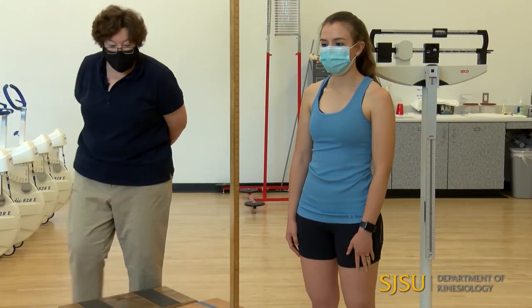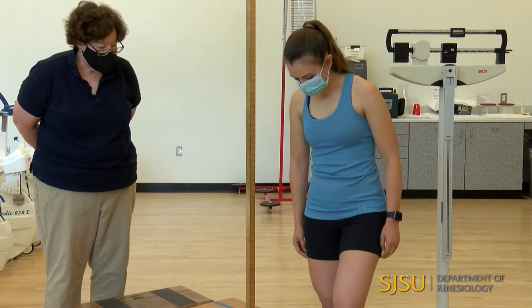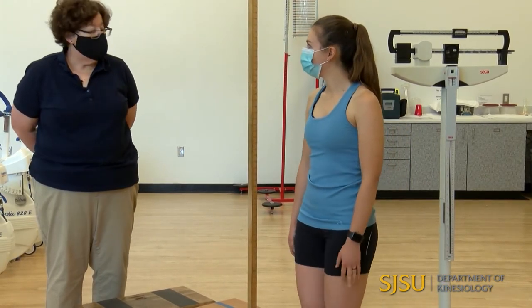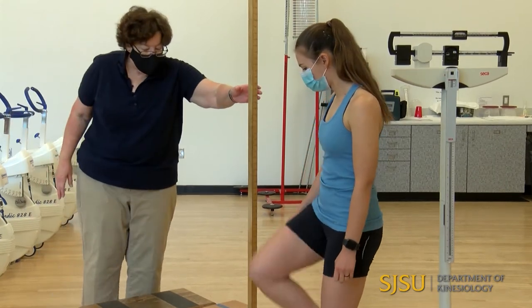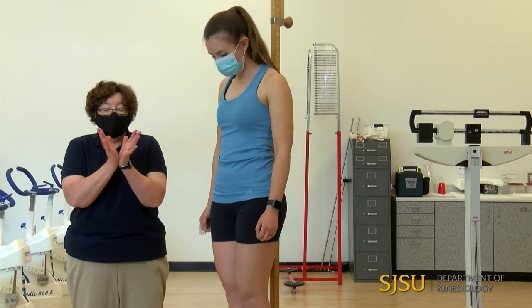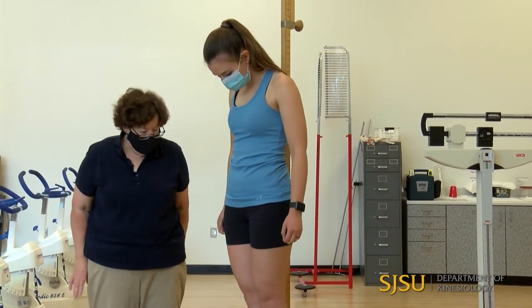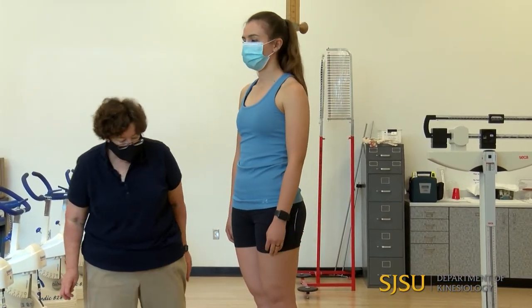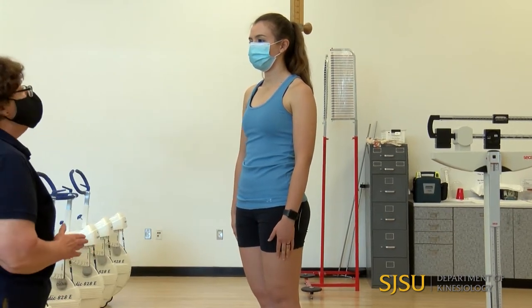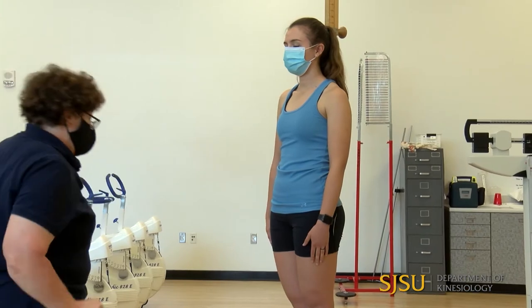To measure height, we need to have shoes off. Professor Carrillo has volunteered to be our demonstrator. She's going to step up on the stadiometer, with her heels together and feet apart. This is a standardized procedure. I'm going to look and make sure that she's centered on the stadiometer — that looks good.